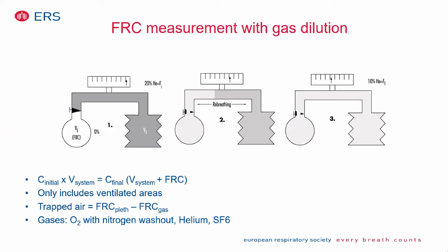And the difference, the subtraction of the volume that you've measured with the body, less the volume measured by the gas dilution techniques, is what we call the trapped air. So that's air that does not participate in gas exchange.